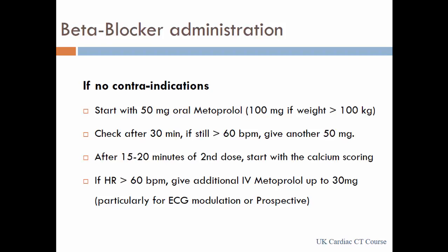So this is purely done by the radiographers. They do everything. I just prescribe it on the performer. If I was to give intravenous, then I would be getting up to do that myself, because the non-medical staff cannot give intravenous beta blockers. We, as doctors, will have to give intravenous beta blockade. So then I have to give up in the middle of my reporting.